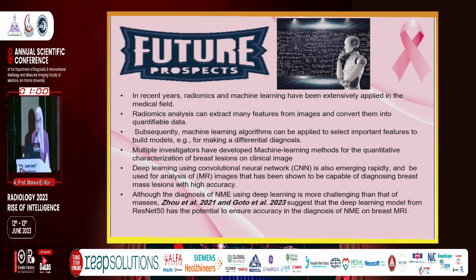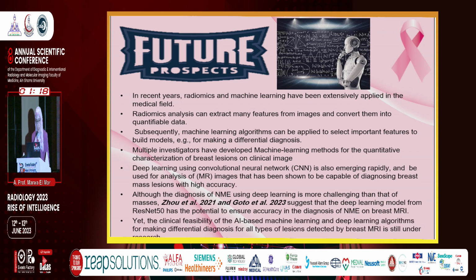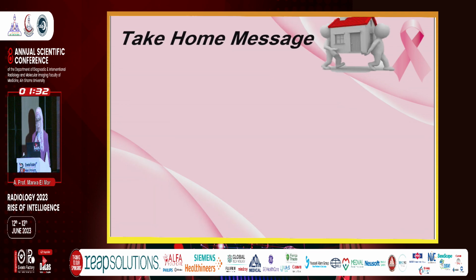Although the diagnosis of non-mass enhancing lesions using deep learning is more challenging than for masses, yet Zhou and Goto suggest that the deep learning models they used have high diagnostic accuracy in diagnosis of non-mass enhancing lesions. Yet the clinical feasibility of AI-based machine learning and deep learning algorithms for making differential diagnosis for all types of lesions detected by breast MRI is still under research.